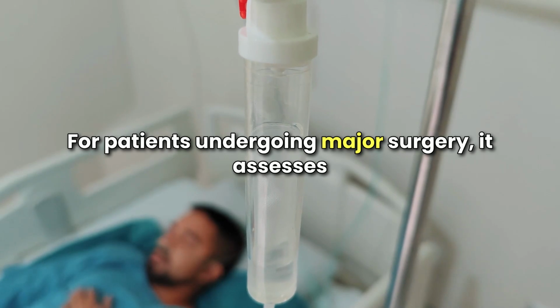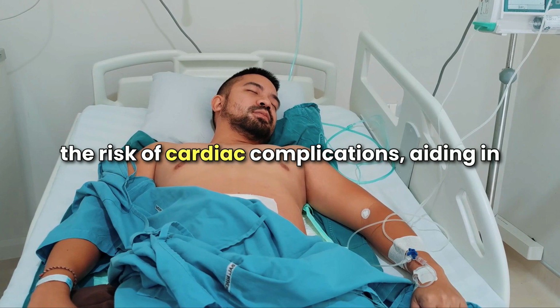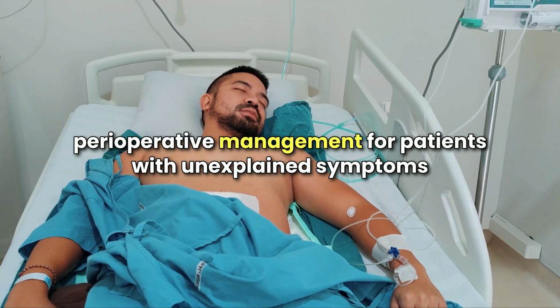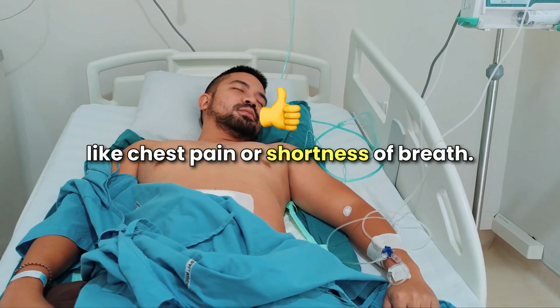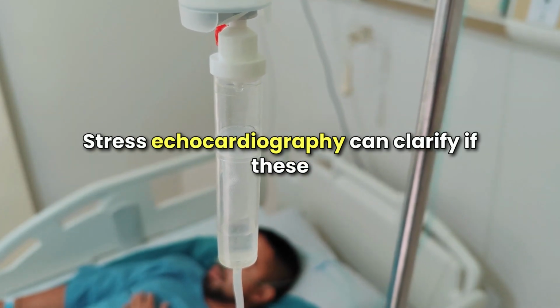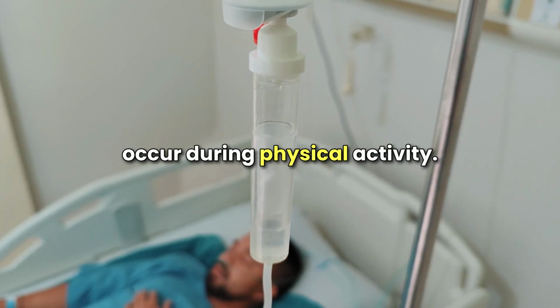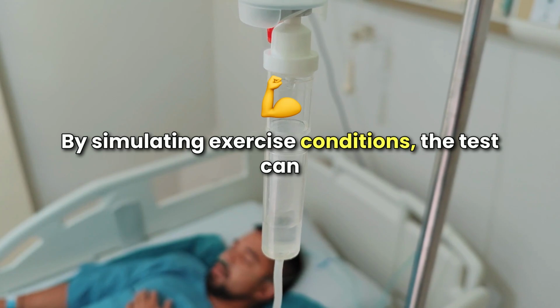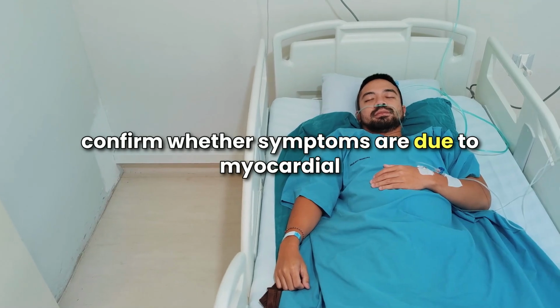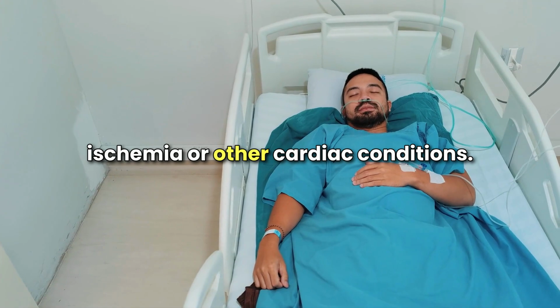For patients undergoing major surgery, it assesses the risk of cardiac complications, aiding in perioperative management. For patients with unexplained symptoms like chest pain or shortness of breath, stress echocardiography can clarify if these are heart-related, particularly when they occur during physical activity. By simulating exercise conditions, the test can confirm whether symptoms are due to myocardial ischemia or other cardiac conditions.